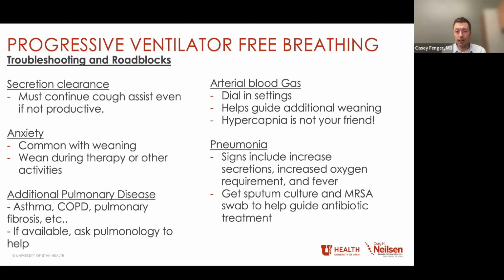We do a lot of arterial blood gases. This really helps us dial in the settings, mainly monitoring for CO2 retention. And this is because hypercapnia is not your friend, right? It's a bad thing. It can lead to somnolence and respiratory failure. So it's something we really want to avoid. The other thing with hypercapnia is it can be sneaky. It can gradually build over time and you don't know it until you run into a problem. And so whenever we make a big change with the ventilator, we're always checking blood gases to make sure the patient's ventilating okay, breathing off the CO2.